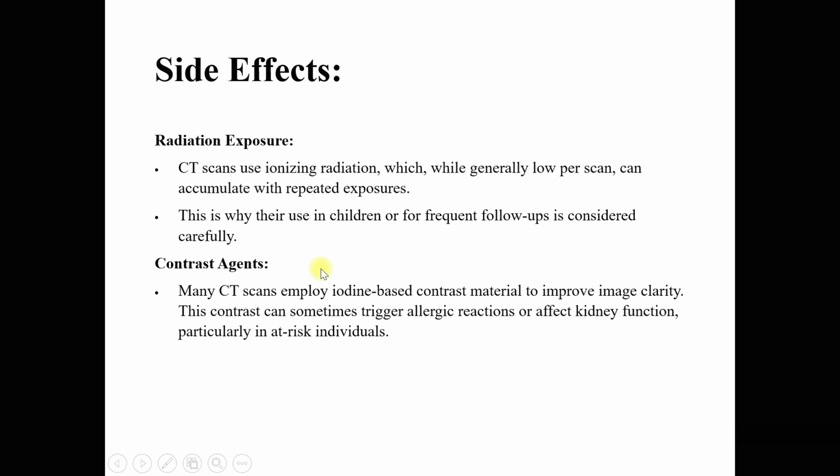Contrast agents. Many CT scans employ iodine-based contrast material to improve image clarity. These contrasts can sometimes trigger allergic reactions or affect kidney function, particularly in high-risk individuals like patients with CKD or chronic kidney disease or any renal impairment. So in this condition, we have to be cautious while using oral contrasts or any contrasts.